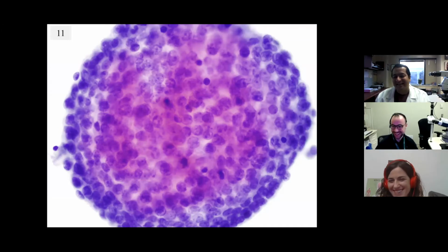This patient has numerous bilateral lung nodules, and she is 59 years old. There is a history of a malignancy somewhere, a carcinoma. What is the most likely primary site with this morphology? This is something that cytologists have a name for. This is a classic finding.